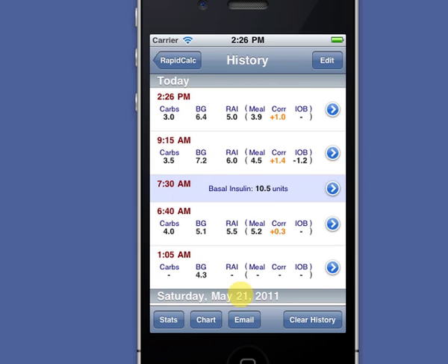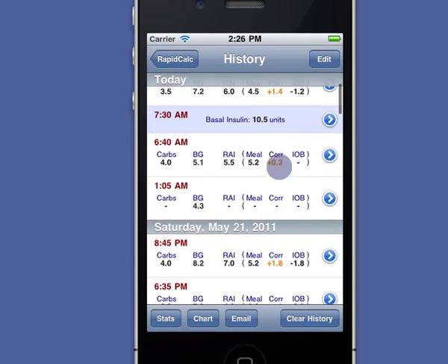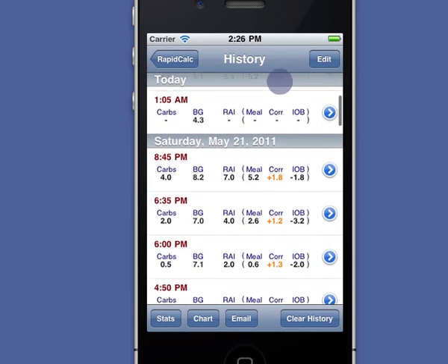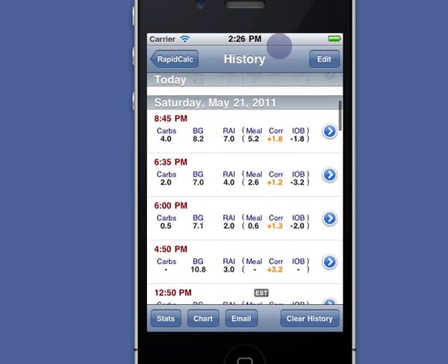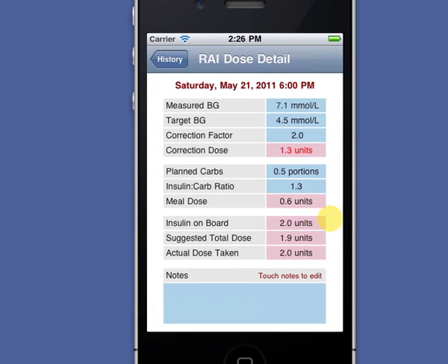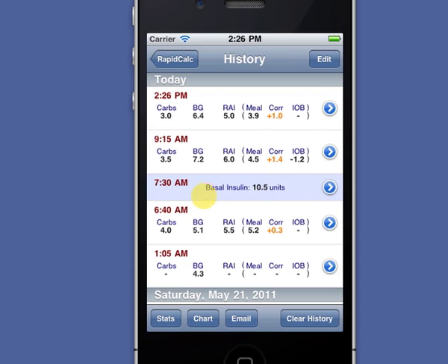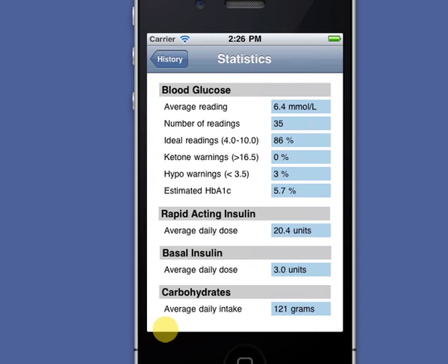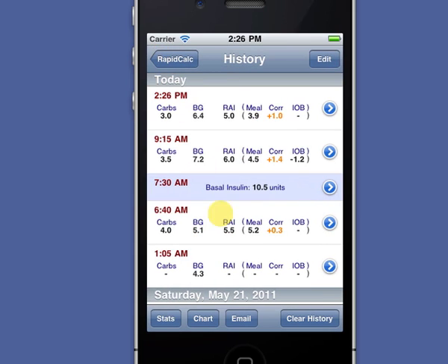Here's my dose history broken down by day and time. I can drill down to see the details for any of these records, view my key performance statistics, or export my data.